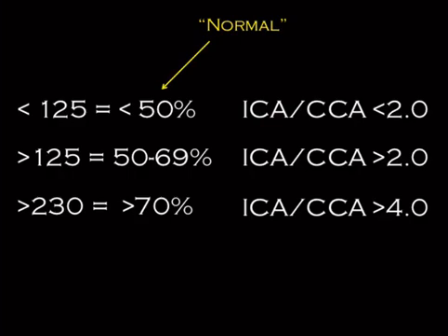So developing criteria that can tell the difference between those two based on spectral broadening, something that's extremely variable between techs, is really, really dumb. Of course, the real reason that you write a paper like that is so you can get promoted in academics. I digress. The thing to remember here, I'll back up.